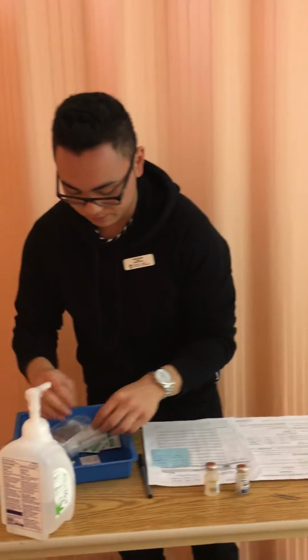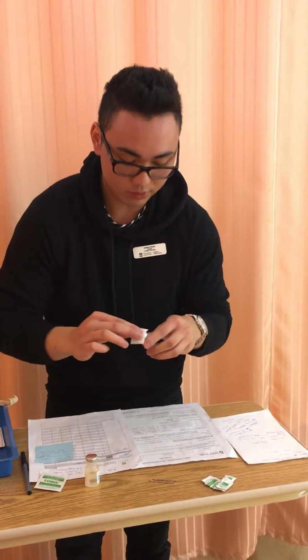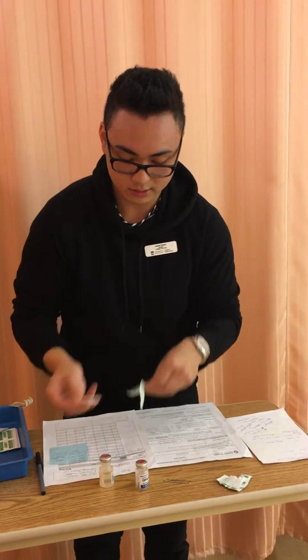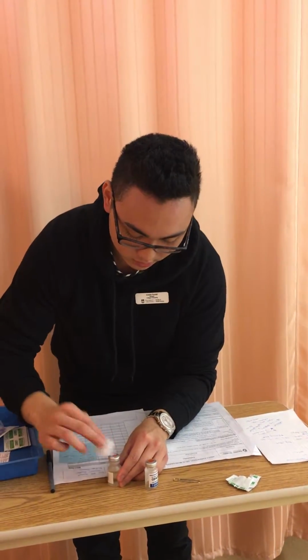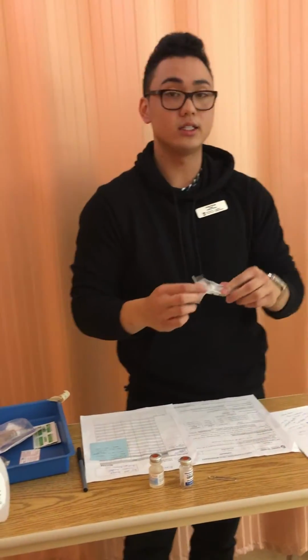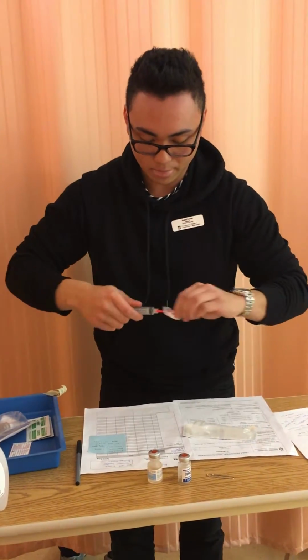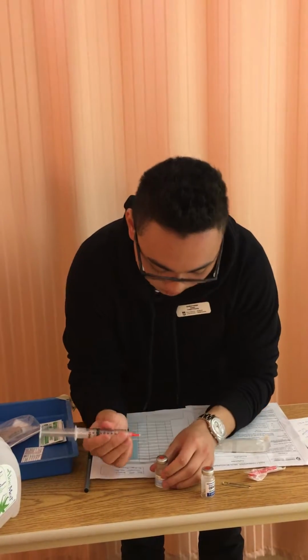So we'll go ahead with preparing our medication. So we're going to swab both vials. 30 seconds has passed. Another one. Sterile water. Okay, 30 seconds has passed. Okay. So we'll need 10 milliliters of sterile water, and we have a 10 milliliter syringe here. So we'll draw approximately 10 milliliters of air here. We've already swabbed this and let this dry.